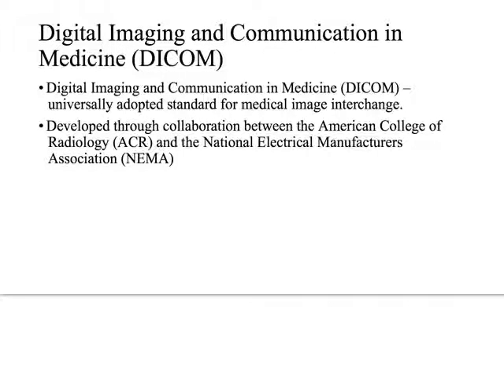DICOM means Digital Imaging and Communication in Medicine. And the book goes into some historical notes about how it was made through a collaboration with the ACR and NEMA. NEMA is still very active in a lot of standardization, particularly around imaging, but all sorts of different kinds of things. I mean, they're just not limited to medicine. They do all sorts of stuff. But they developed this standard back in the 80s. There was a recognized need for it. And it has really evolved into a very robust way of communicating image information.